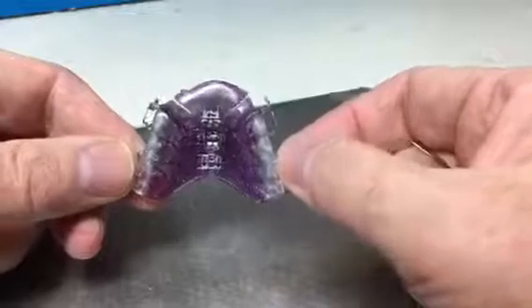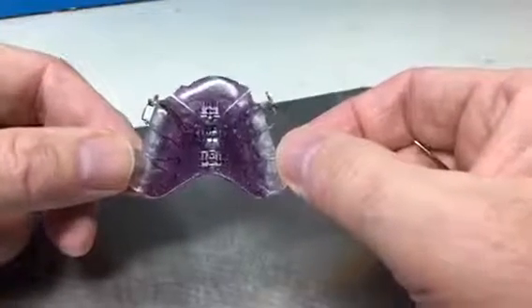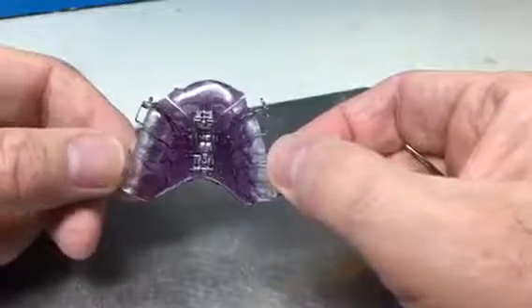I'm activating these two posterior screws now. I've activated each of those screws in the direction of the arrow by a quarter of a millimeter, and again that should be done in mixed dentition cases about once every five days, in permanent dentition once every seven days.